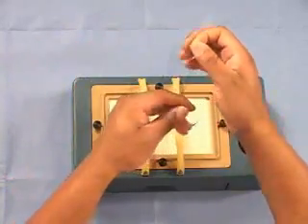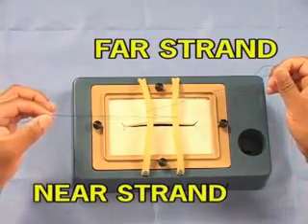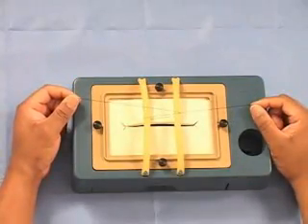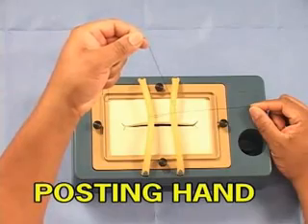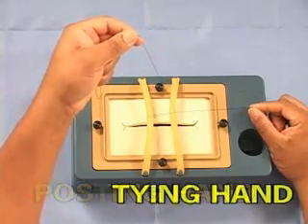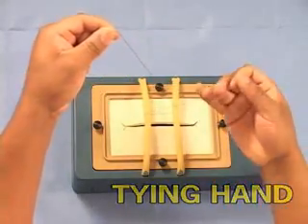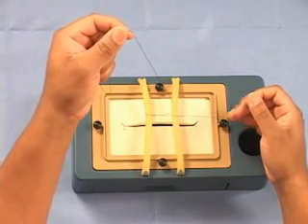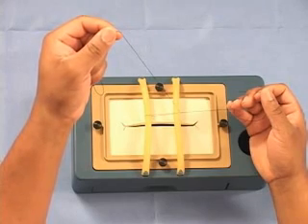If I cross the strand the opposite way, the near strand and far strand just changed hands. Two other terms we want to be familiar with are the tying hand and the posting hand. The posting hand will provide upward pressure throughout this knot tying process. The tying hand will provide the throws. So in this demonstration, my left hand will be the posting hand and the right hand will be the tying hand. For the one-handed knot, you will tie and push with the same hand.